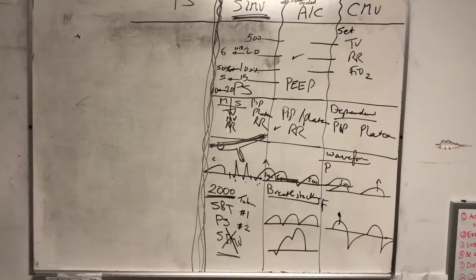So for pressure support, this is the simplest mode of ventilation. I would say more people are familiar with BiPAP now than with vents. So unfortunately, I have to tell people that this is the BiPAP of the vent. This is like the BiPAP of the vent, exactly.